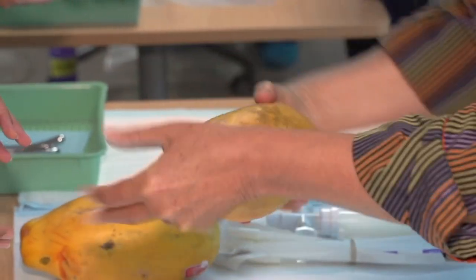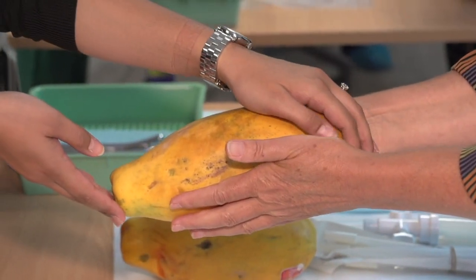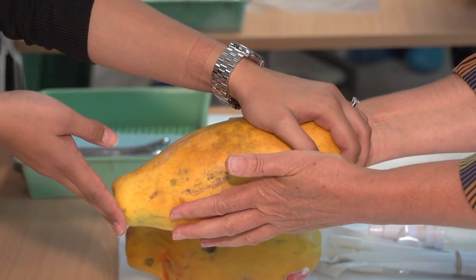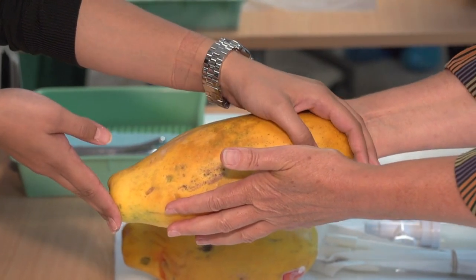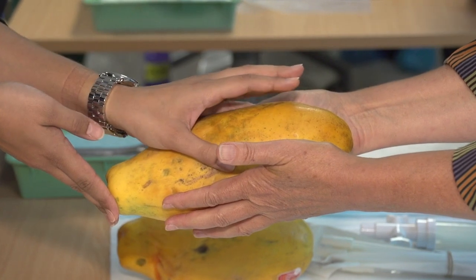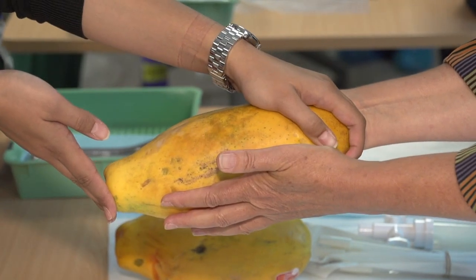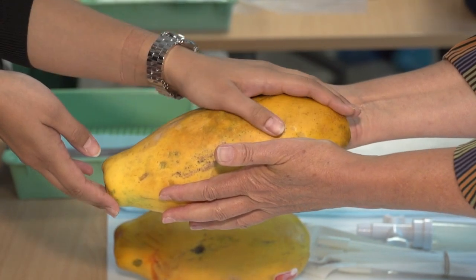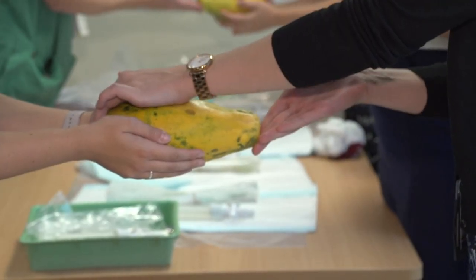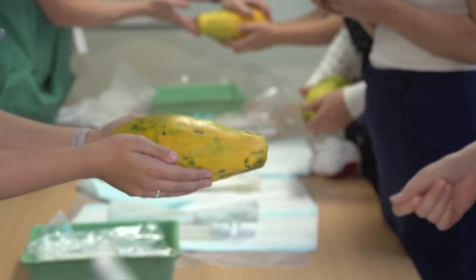The first thing you're going to do is a pretend vaginal examination. One person is going to hold the papaya and the other one is going to shut their eyes and feel it, trying to think about the size and shape of it, where the cavity is going to be, and how far in you think you're going to push your suction tool.